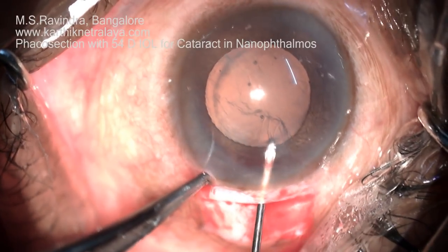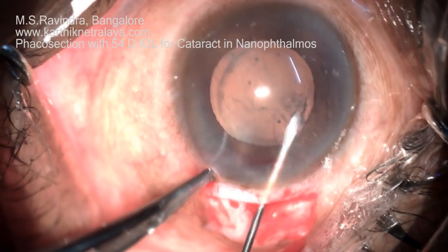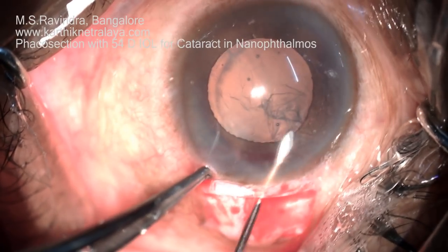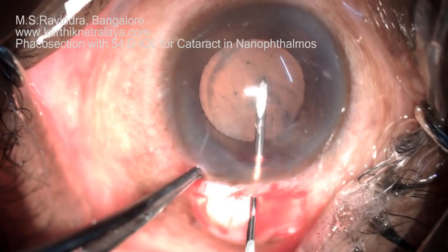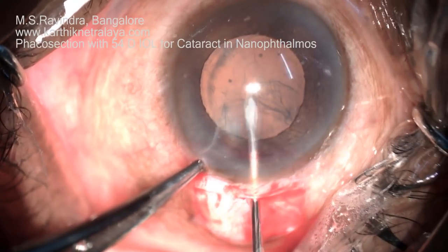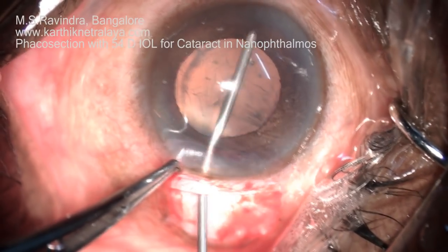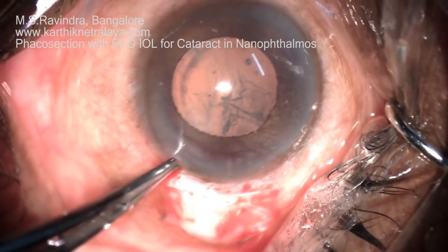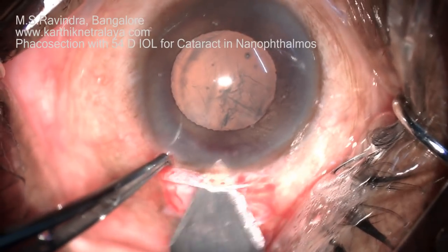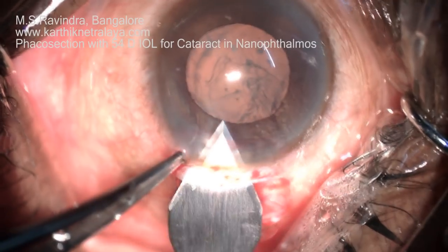The tunnel floor pinpoint entry technique is a technique where the cystitome is taken through the floor of the tunnel rather than through the full length of the tunnel. The entry point is at the limbus through the floor of the tunnel. Intracameral 1% lignocaine is now being injected, as it is done under topical anesthesia.